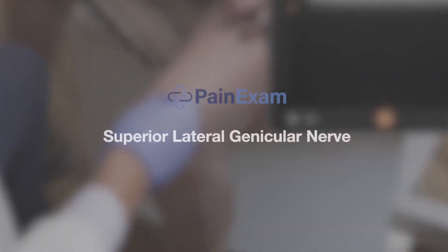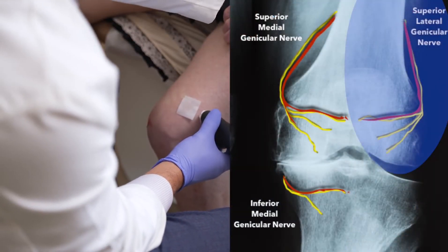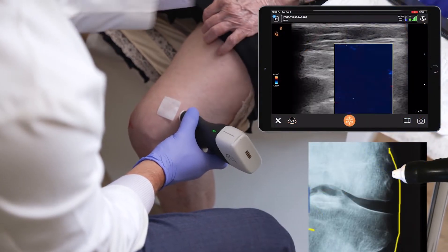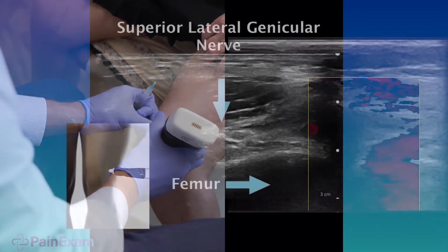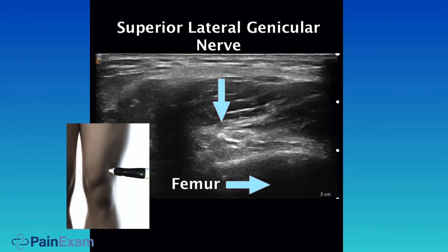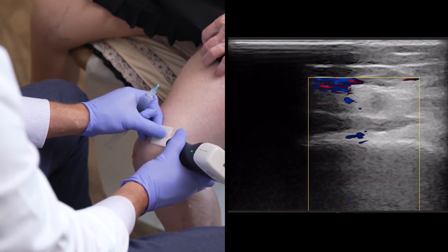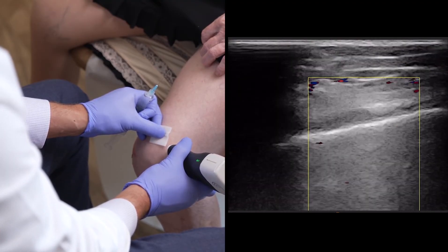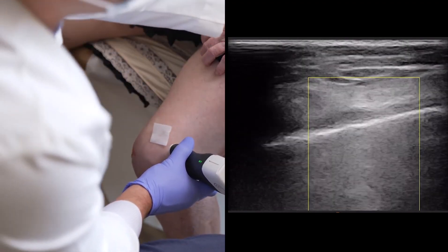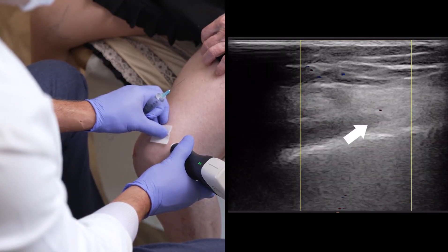Now we're going to scan for the lateral branch, which also runs with a blood vessel. I'm going to put my Doppler on as I scan for the blood vessel to help me isolate the nerve. I like to go as distal as possible on the epicondyle. As I'm scanning proximal to distal, I'm looking for the nerve from the blood vessel. Too much pressure and the blood vessel will disappear, so it's important not to press too hard. But I found the artery, and the nerve is right under it.